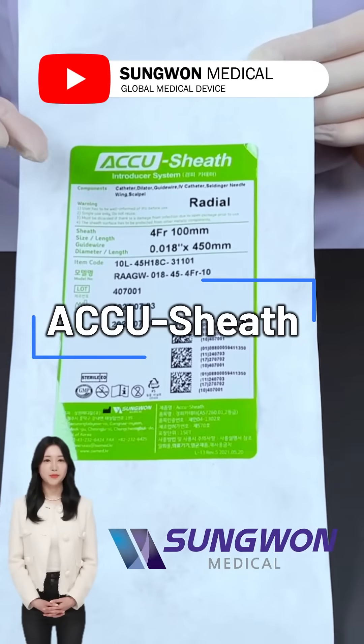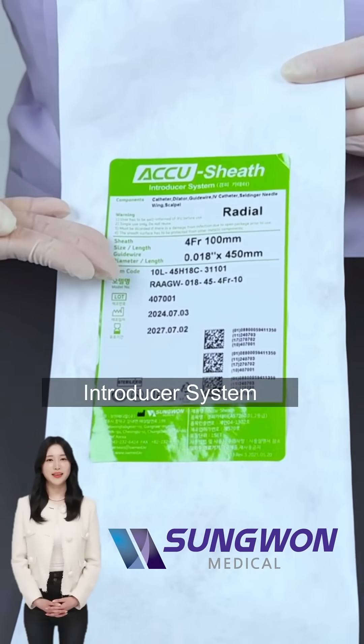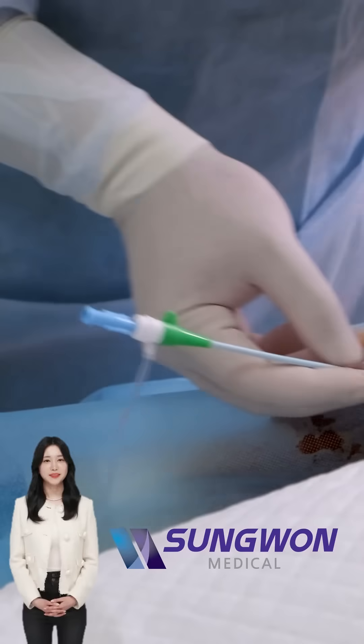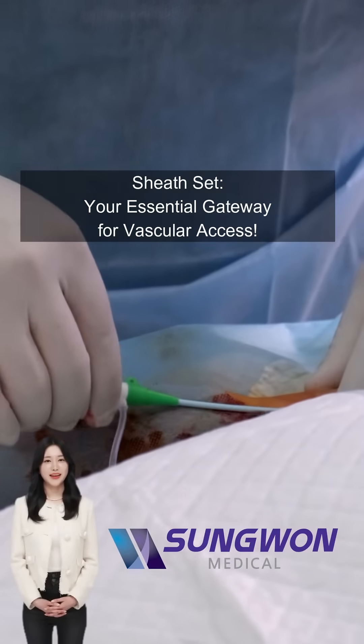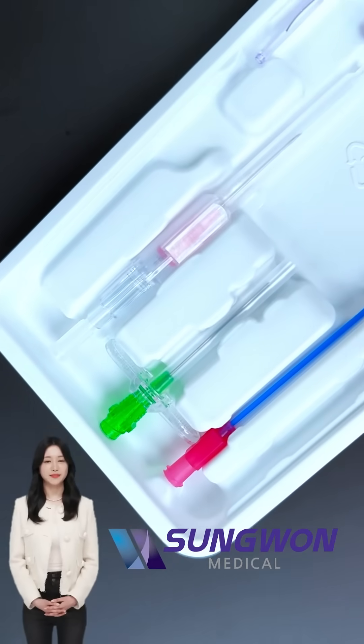Hello everyone, welcome to Sungwon Medical's healthcare information channel. Today we're taking a quick look at a sheath set, a vital tool used in minimally invasive procedures for both veins and arteries. Think of it as the entrance point for catheters and guide wires, ensuring a smooth and safe passage into blood vessels.